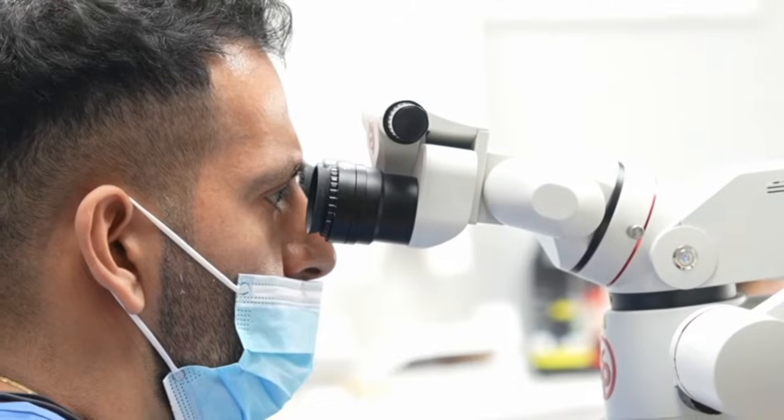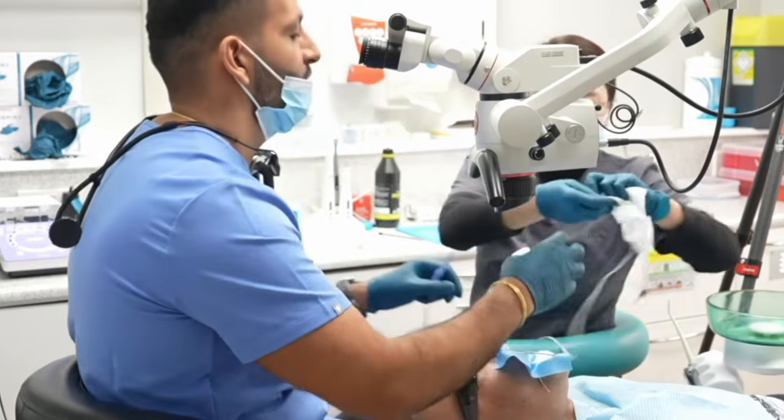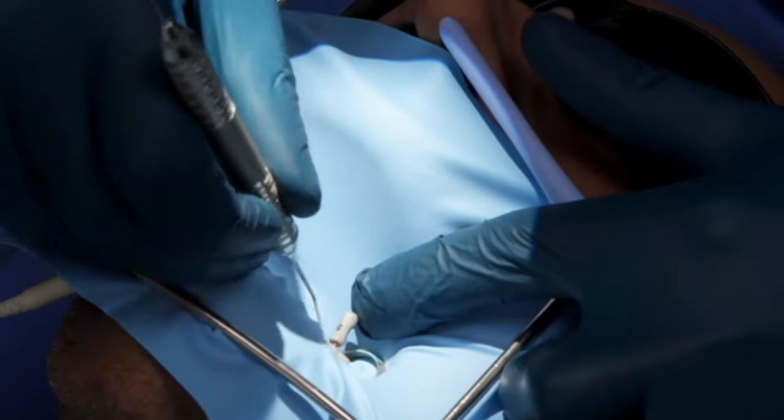So then we need to consider our shaping process. Once we determined our working length, we needed to decide how we were going to prepare these canals. I decided to use the HiFlex EDM OGSF sequence, but actually it should be the anatomy that guides the preparation and not a manufacturer sequence. We did the orifice opener, the glider. The glider is really good at producing a glide path, which is a smooth, uninterrupted path from the canal orifice to the apical constriction. The glider reduces the stress on all the subsequent files to follow.